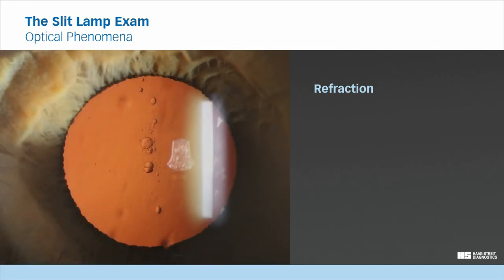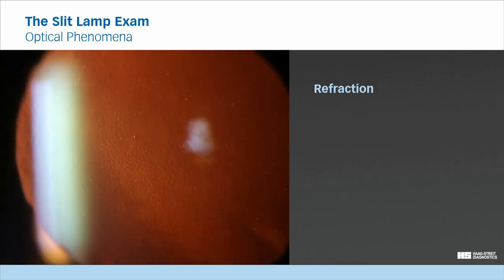During slit lamp examination, this phenomenon can be observed for example in these cysts, which are in the anterior cortex of the lens, or in this case of corneal dystrophy.